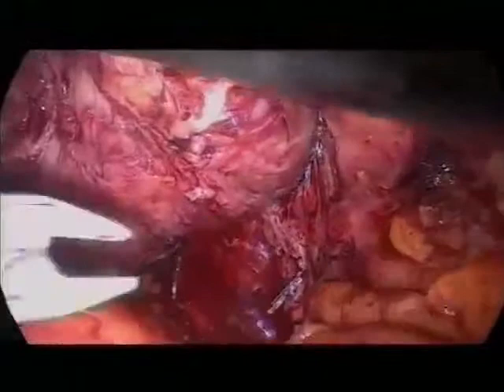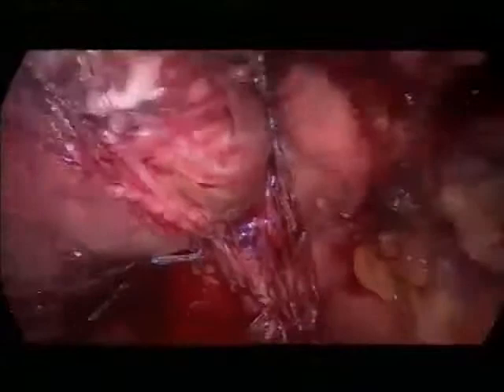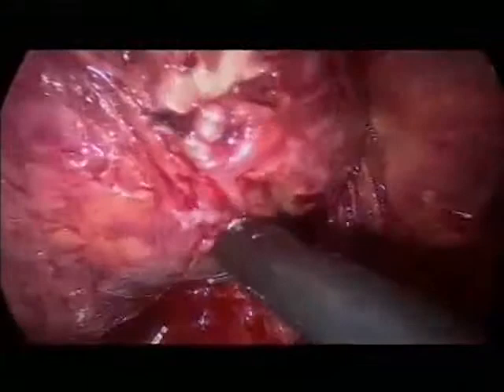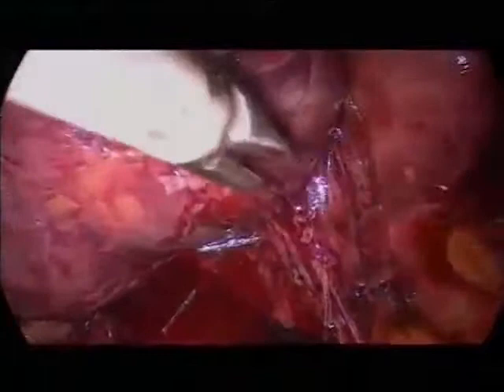Behind the prostate, not this one, a little bit higher. Go back to this artery running. The pedicle was in this area more. No, the small pedicle running on the prostate. You see it? Exactly, this one. I think this pedicle is very important because if you cut it, you are in the right plane. If you don't cut it, you will leave some tissue on the prostate.